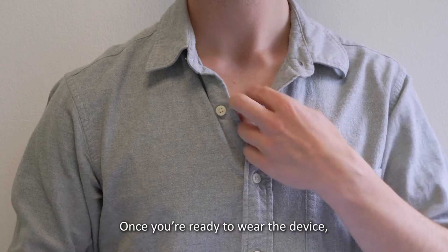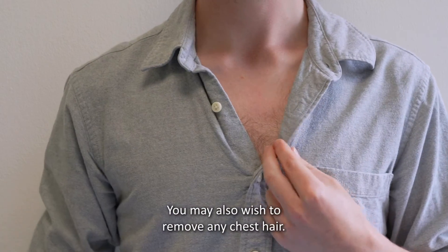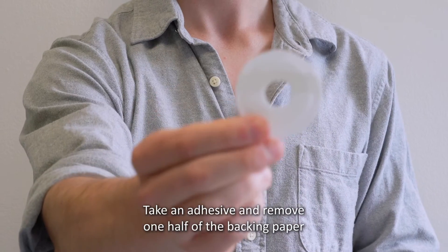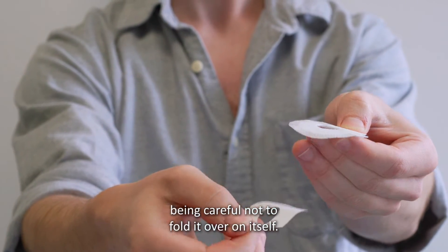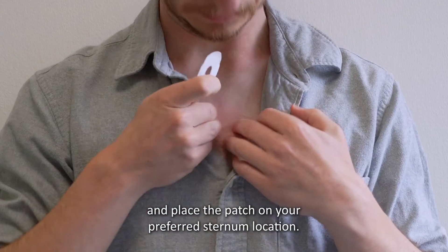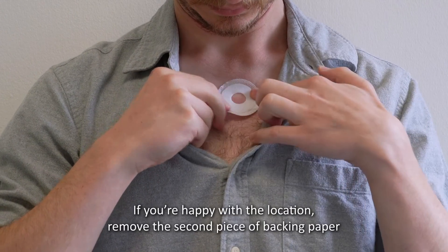Once you're ready to wear the device, first make sure your sternum is clean and dry. You may also wish to remove any chest hair. Take an adhesive and remove one half of the backing paper to reveal the sticky surface, being careful not to fold it over on itself. Hold the side with the backing paper still attached and place the patch on your preferred sternum location.